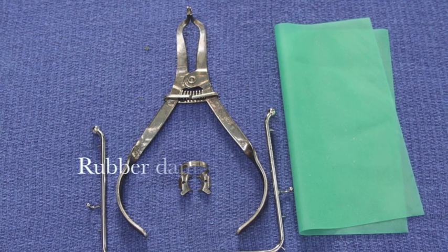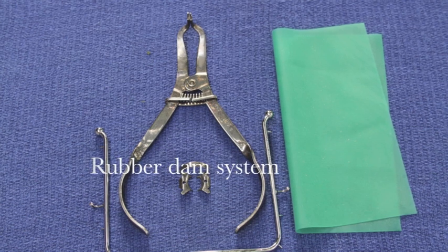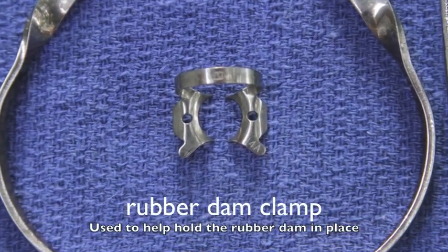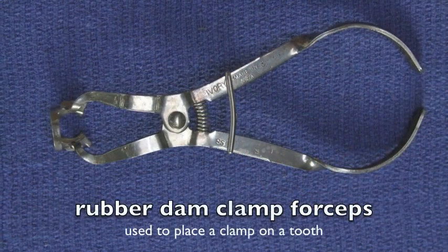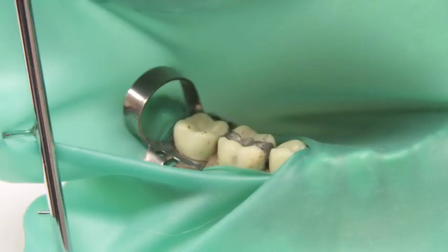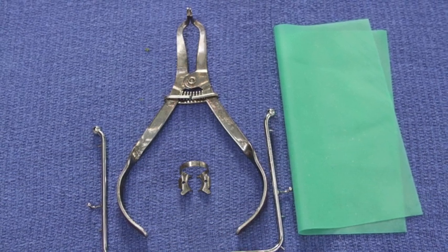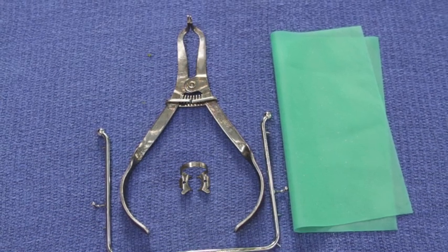The rubber dam system is designed to isolate the teeth from the rest of the oral cavity. This is done because control of moisture is very important to the long-term success of dental restorations. The rubber dam clamp is placed over the tooth to secure the rubber dam material to the tooth. The rubber dam clamp forceps are used to place the rubber dam clamp on the tooth. The rubber dam material is what actually keeps the moisture away from the teeth. The rubber dam frame stretches the rubber dam material so the dentist and staff can easily visualize the teeth.